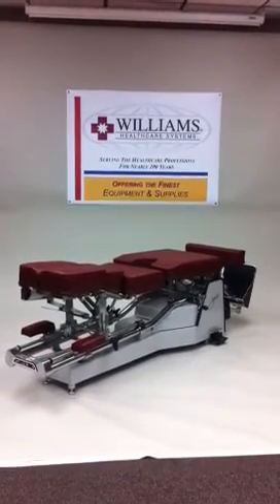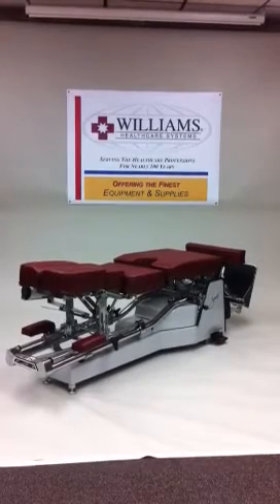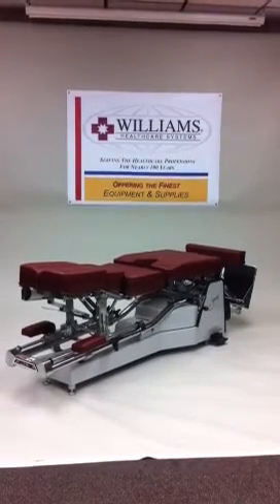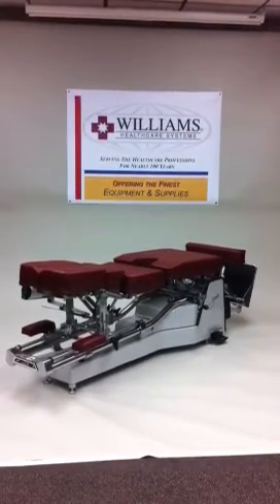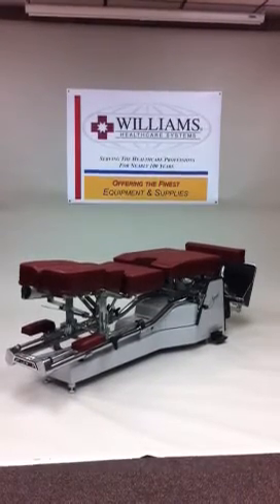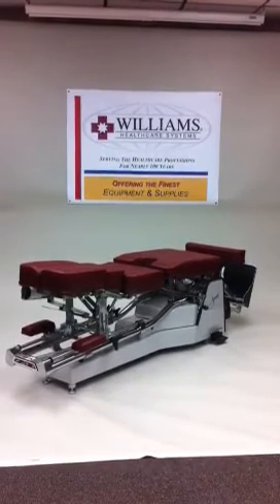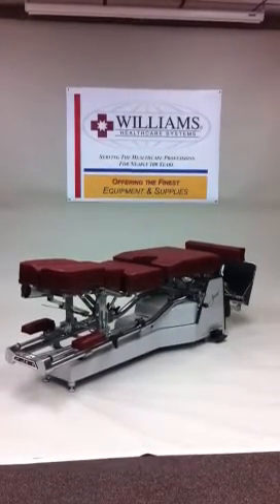We are pleased to present the Zenith III Model 210 Utility Hi-Lo Table. This is the third generation Zenith table which has exclusive features to provide for your and your patient treatment needs. Featuring a five-year limited parts warranty and anatomically correct cushions which adjust to support the patient comfortably for relaxation and better results.